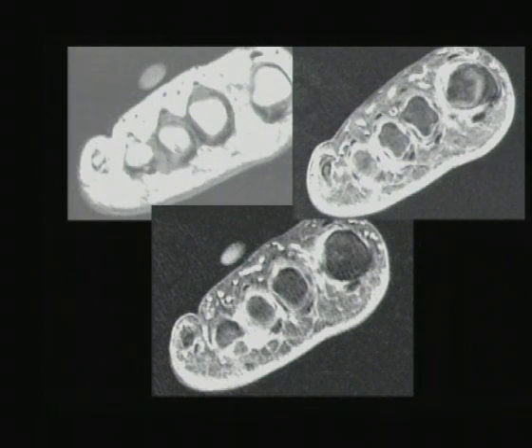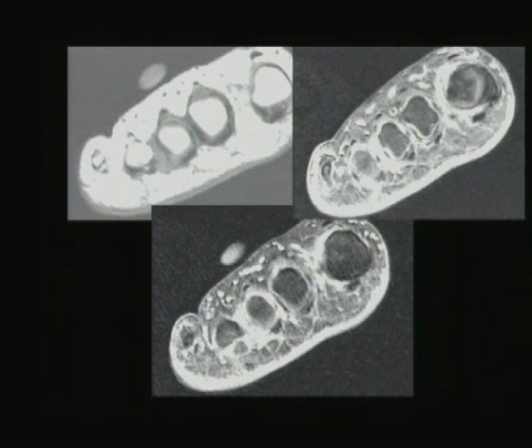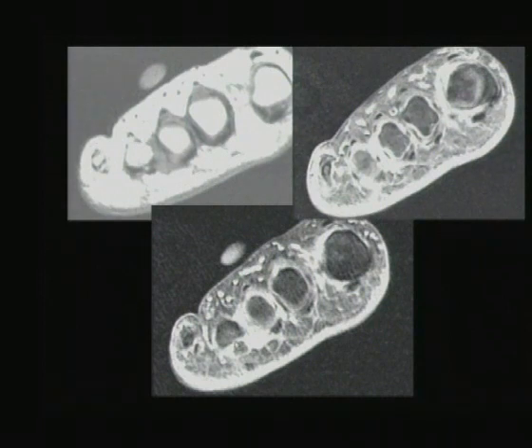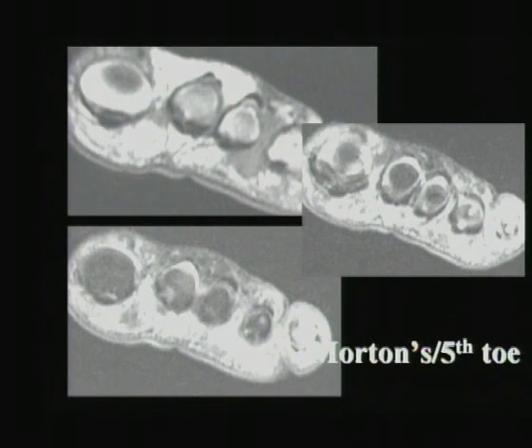Most Morton's neuromas are quite small — this large one represents maybe 2-3% of what we see. If you give contrast, they usually — not always — enhance fairly intensely. So if they enhance intensely, it is most definitively a Morton's neuroma. If they don't enhance, it still probably is a Morton's neuroma. Here we see a large dumbbell lesion, not bright on T2, and intensely enhancing.